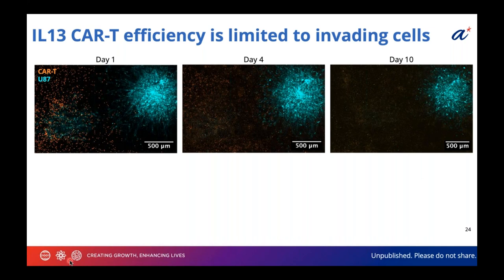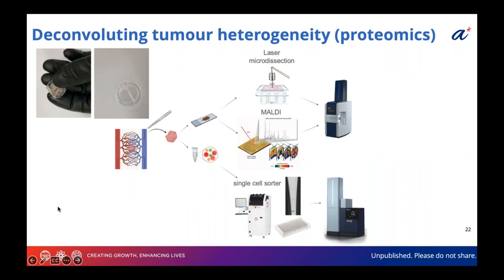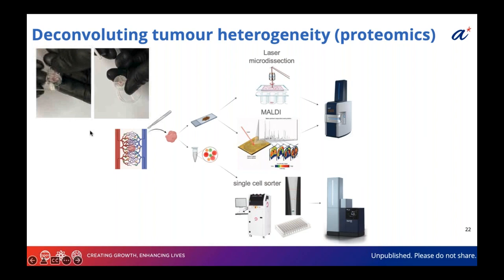So if I go back to this slide, what we did was, if you freeze the whole thing, you just have to peel off the film at the bottom and then pop it out like a popsicle. If you're looking to do cryosection, or just take everything out and mush it, it's even easier because you just put your favorite enzyme in there, lyse everything, and then pull it out. Or you can dig it out after you remove the film and then you just lyse it.